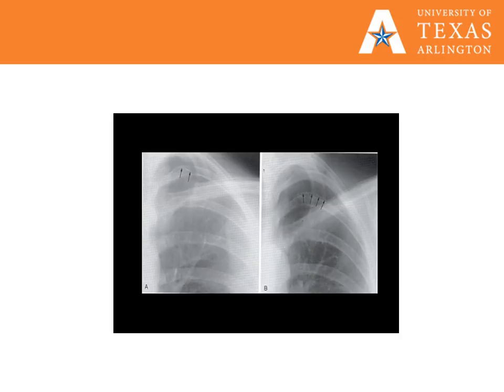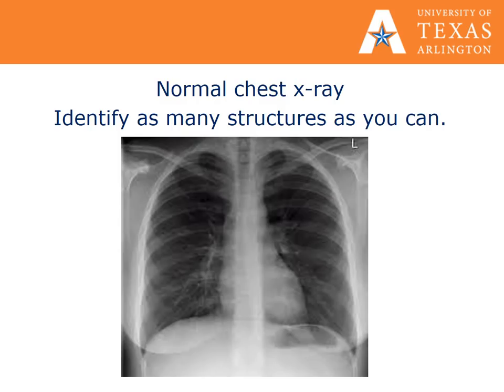Here is an example of a pneumothorax with an inspiratory and expiratory film. Notice how the pneumothorax becomes relatively larger in picture B, which is the expiratory film. This is an example of a normal chest X-ray — try to identify as many structures as you can.